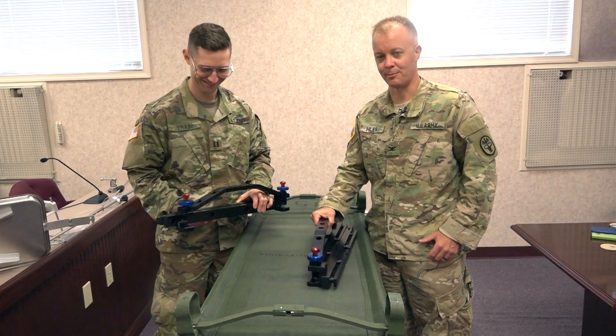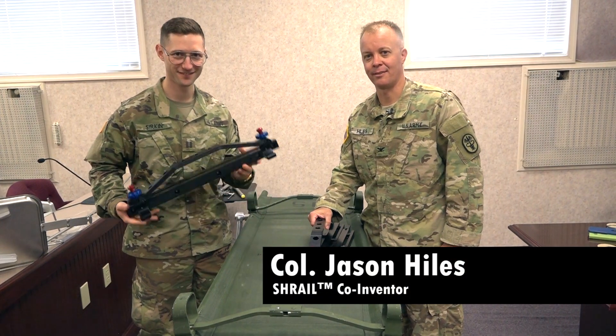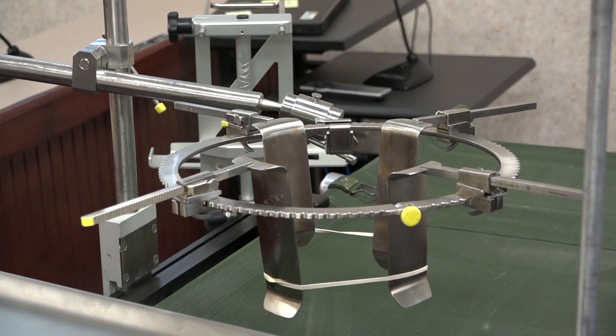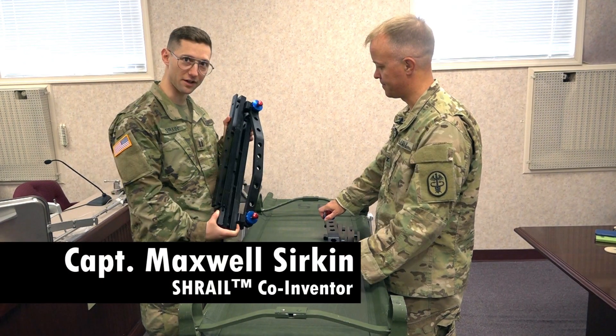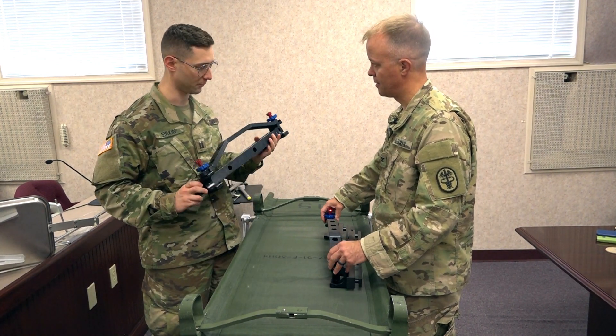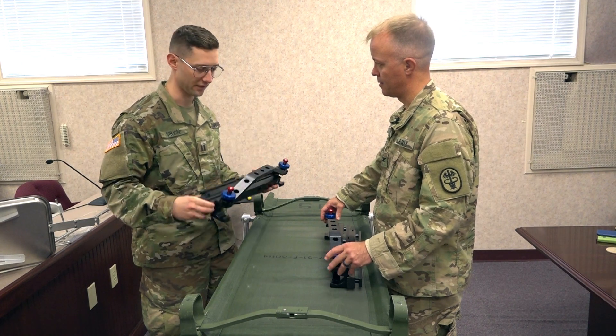We're going to take the Shrail and assemble it on an inverted litter, then flip the litter over once it's assembled so you can see it. This is how they come packaged before you break them apart. When you're carrying them in a ruck or in a vehicle, there'll be two of these. Each half looks like this.